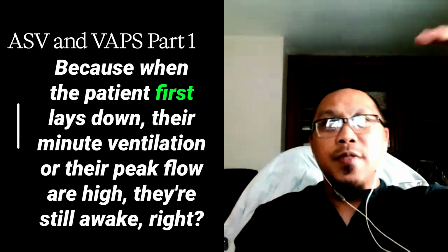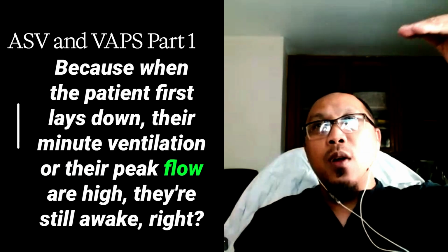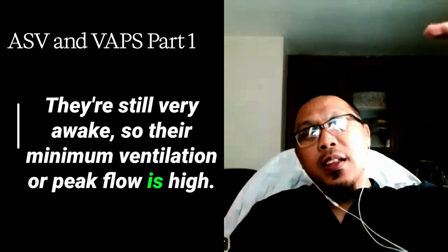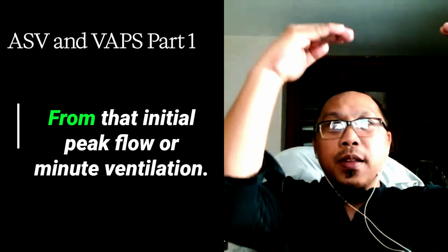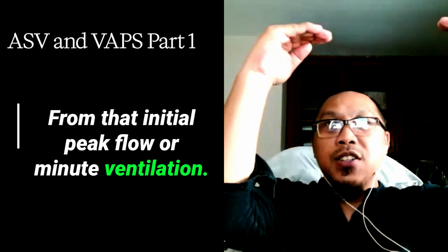Why? Because when the patient first lies down, their minute ventilation or their peak flow are high. They're still awake, right? They're still very awake. So their minute ventilation or peak flow is high. The device allows for them to have a 5 or 10% drop from that initial peak flow or minute ventilation.